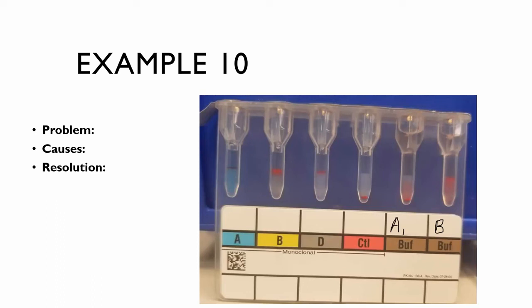Before shaking it, you pull the plasma off the cells and do a saline replacement. If you pull up 2 drops of plasma, you replace it with 2 drops of saline, mix it up, and spin it again. If you read that reaction after the saline replacement and it's negative, you have proven that it was Rouleaux causing the agglutination. Can you explain how to fill this out?